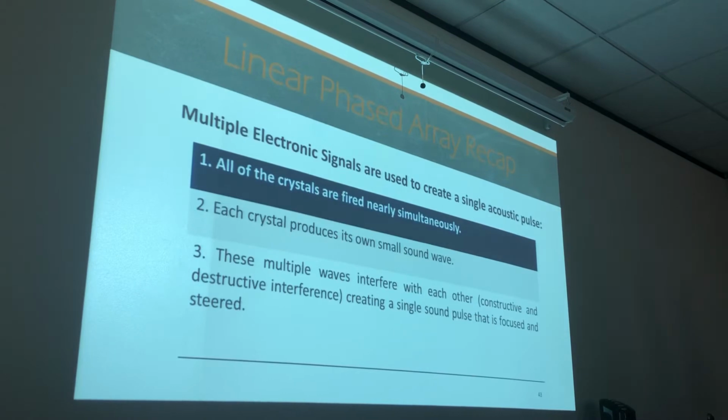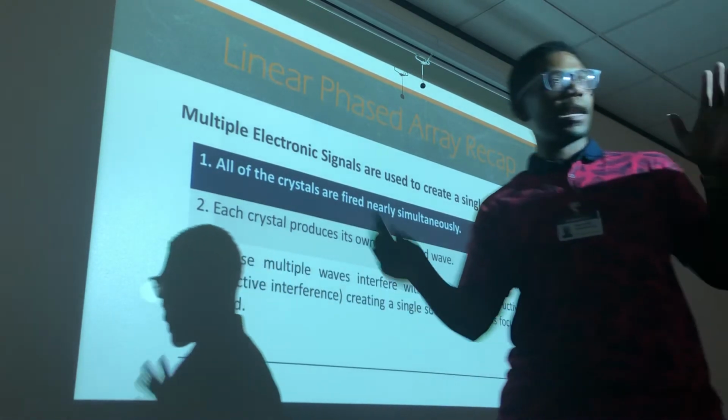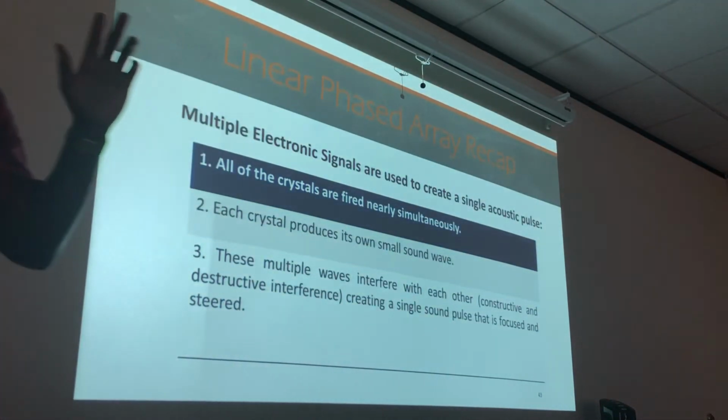So let's do our linear phased array recap, guys. How many crystals are in a linear phased array transducer, Myra? Anybody? Somebody help out. 100 to 300. Guys, I'm not going to lie, you're just going to have to put those crystal numbers to memory.